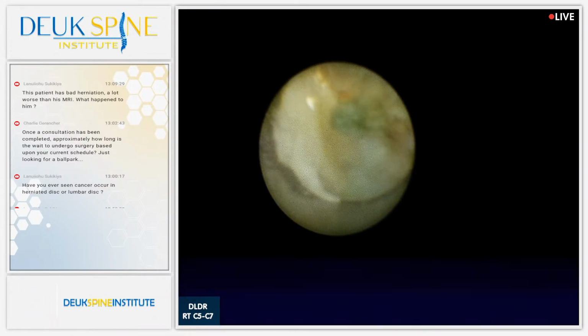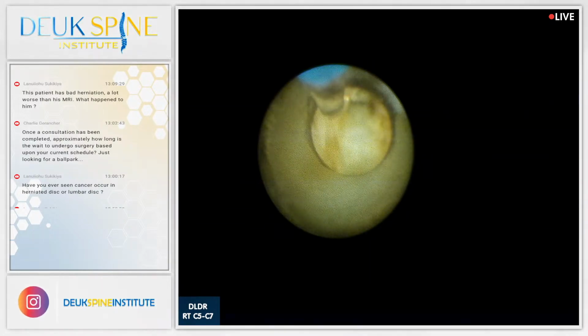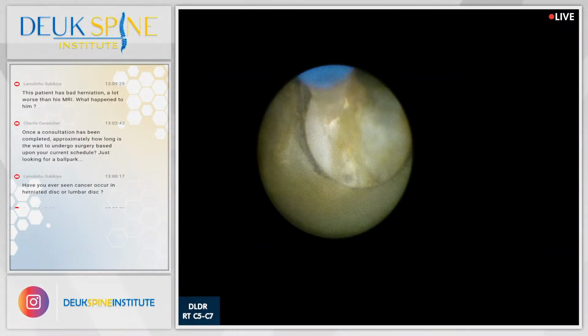Oh my God, this is unbelievable how much herniation's here, huh? Luis?